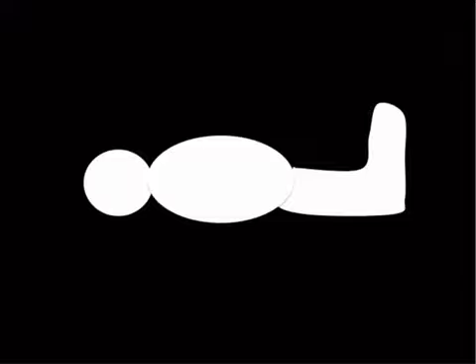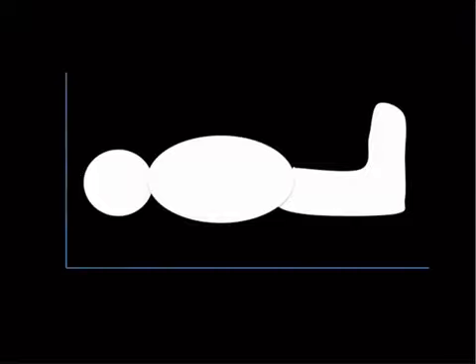So just a quick refresher on how the thickness of a slice is determined. To give each slice a thickness, a band of nuclei must be excited by an excitation pulse. The slope of the slice-select gradient determines the difference in precession frequency between 2 points on that gradient.